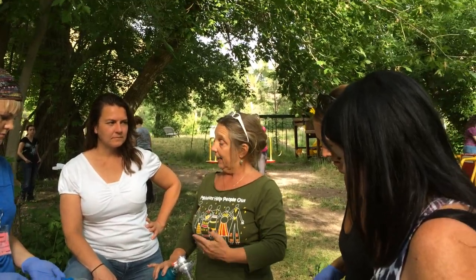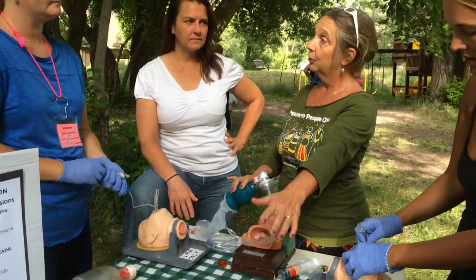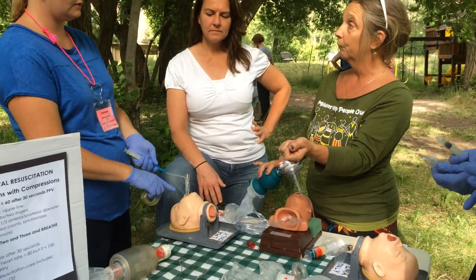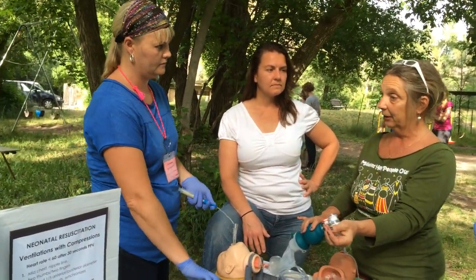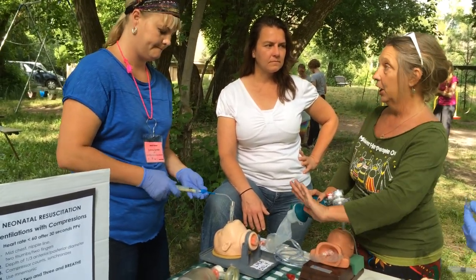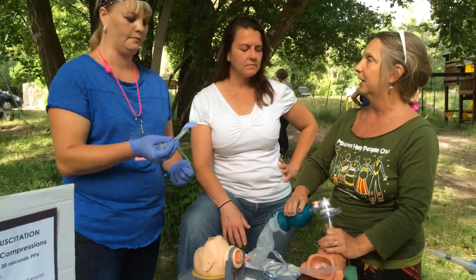To get full and to have resistance with the bag mask ventilator, you're going to go in and take the gas out of the stomach. You should not do this until you've reached that point. Correct. And when you go in to degas the stomach, you want the stomach to be air free so that you're going to see a chest rise when you bag.